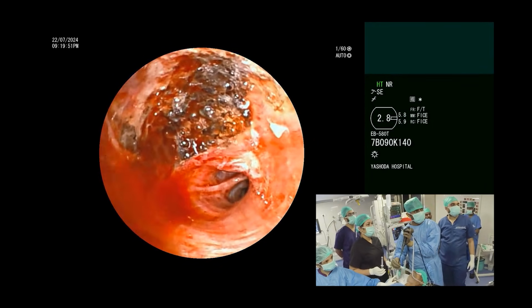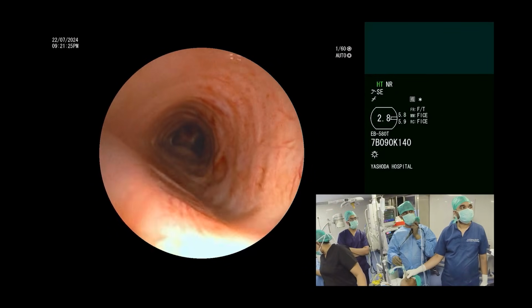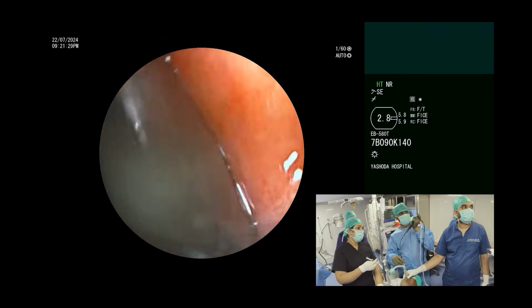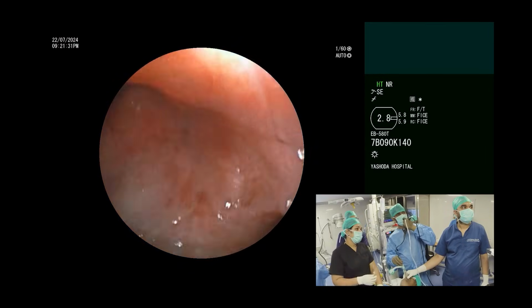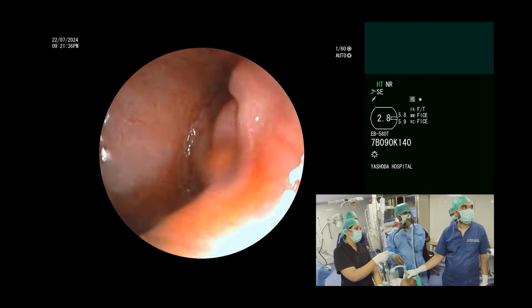And you can also see that the tumor arising from the left main bronchus is completely coagulated, and we are done with the procedure, and now the patient will be extubated on table, and most probably he should be discharged the very same day with proper post-op.